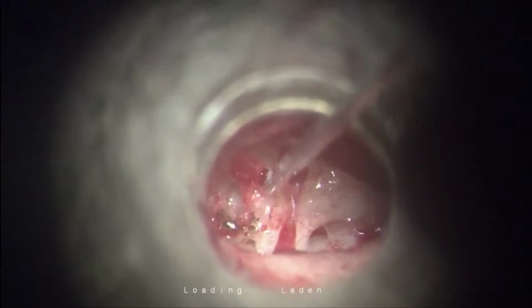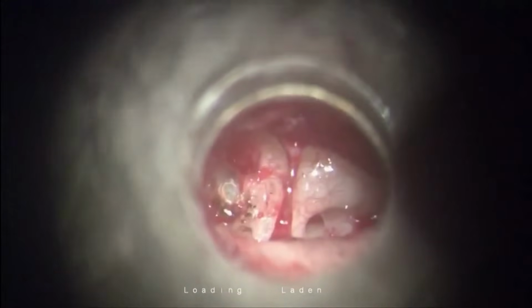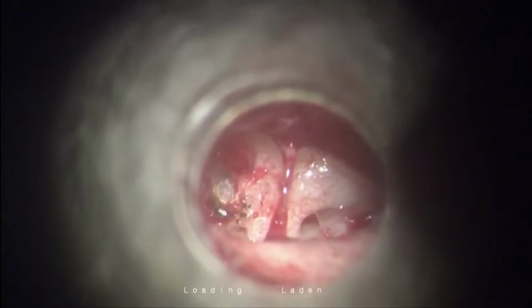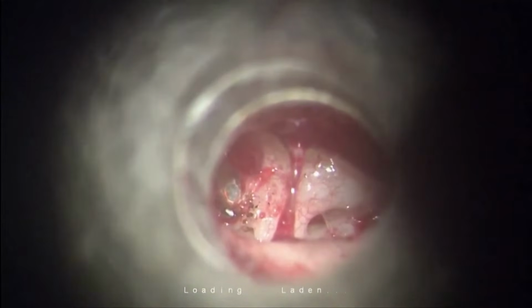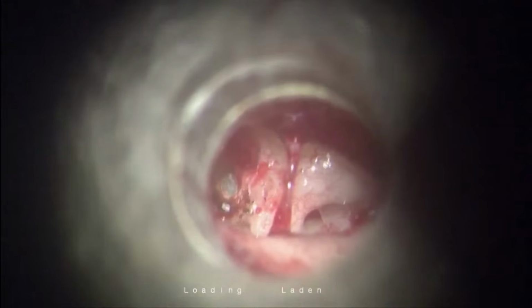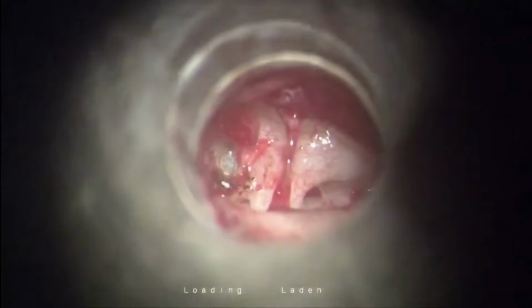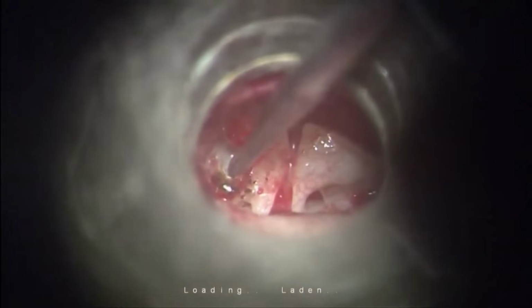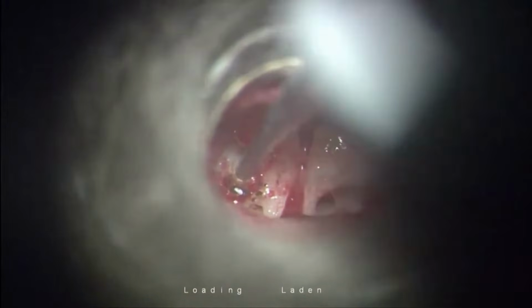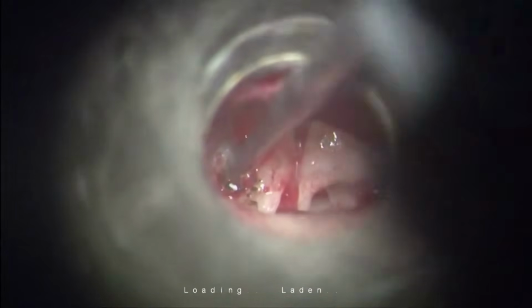Now see, with my beam, it's a single shot, 20 watt, and it didn't go through. Can you see? Yes. Now what are the options with me? To fire again, which I am not going to. Yes, I can fire because it had already thinned out. I can fire with less power, or since it has already thinned out, I can try using a mechanical instrument to penetrate. Can you see this?